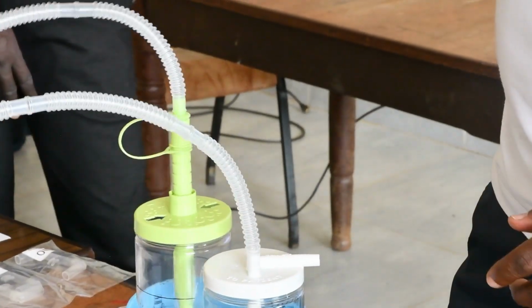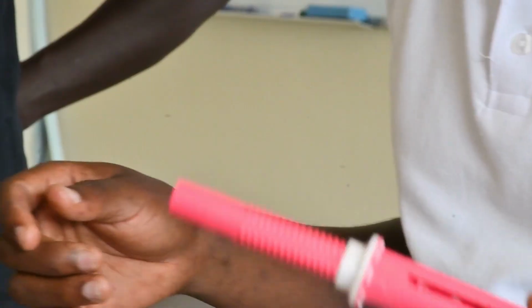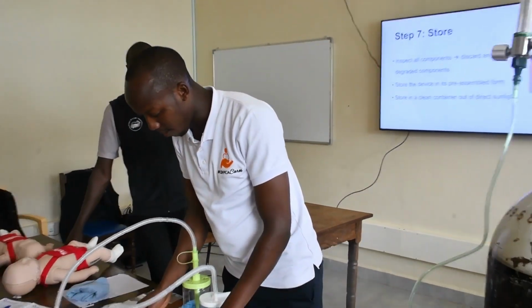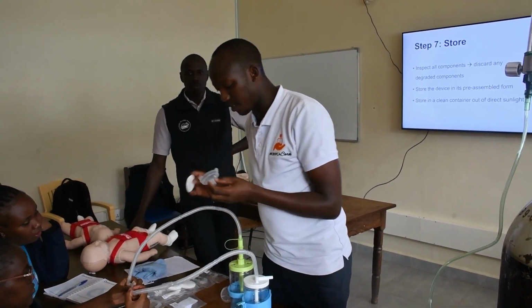Now we come to the blender. Okay, we have the blender here. We can fit it fast. In this case, let's assemble the filter.